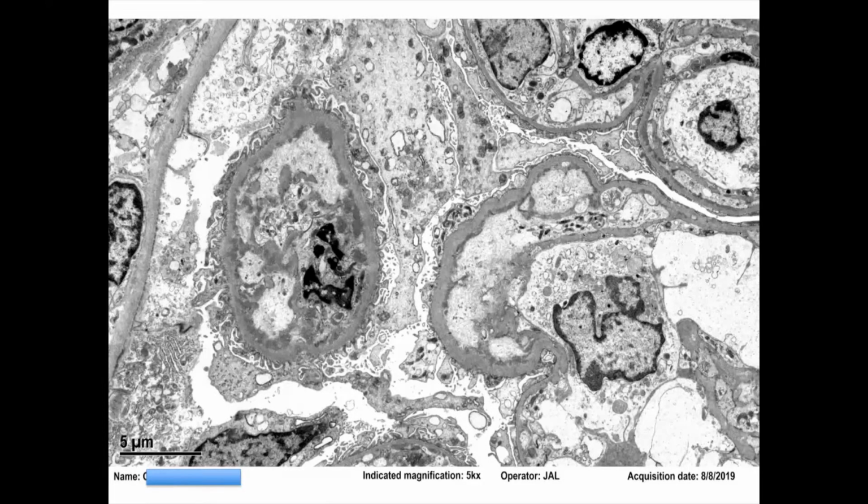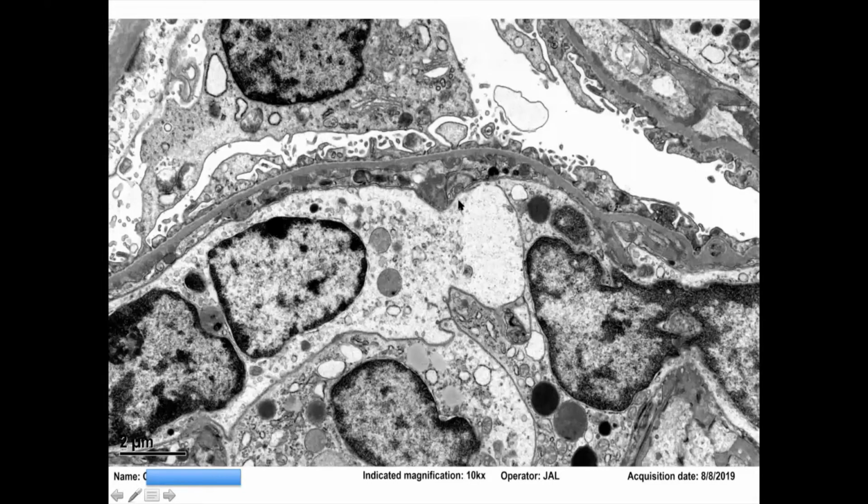Absolutely. Yeah. Well done. So what we have here is subendothelial deposits, exactly. We have lots and lots of subendothelial deposits. We are now at 5K. Let's go to 10K and make sure that yes, basically we do have subendothelial deposits.